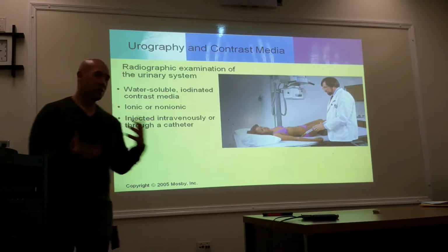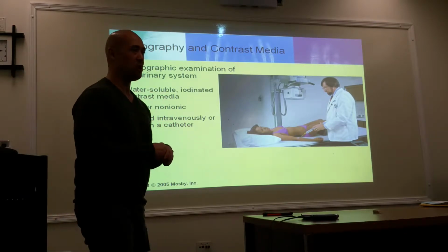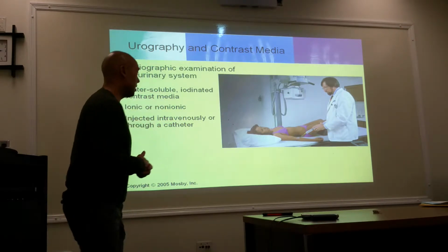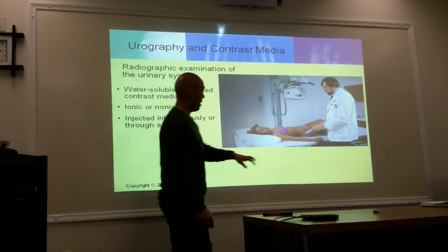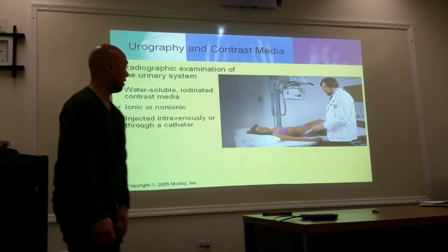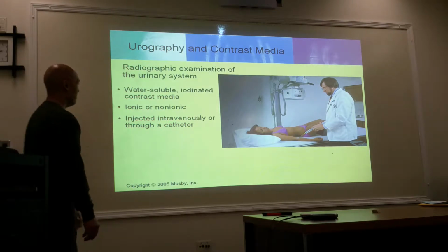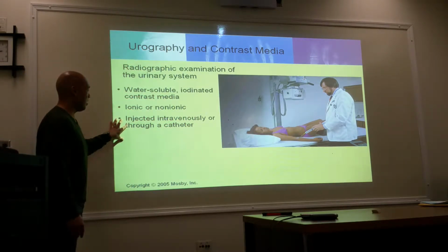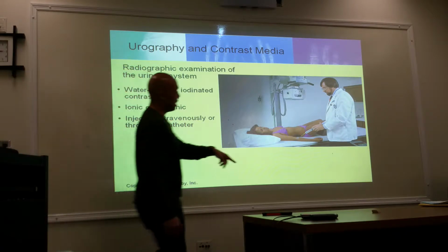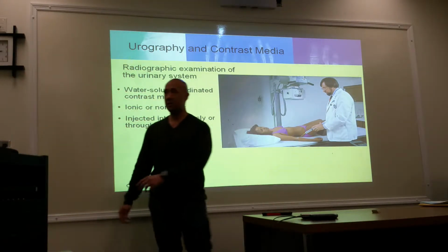Depending on the doctor and the policies of your hospital, you can be using either ionic or non-ionic. Most places now are using non-ionic because it's a little bit safer, but you still have hospitals using ionic forms of iodinated contrast. It is injected intravenously or through a catheter. This will be you guys performing these types of procedures.